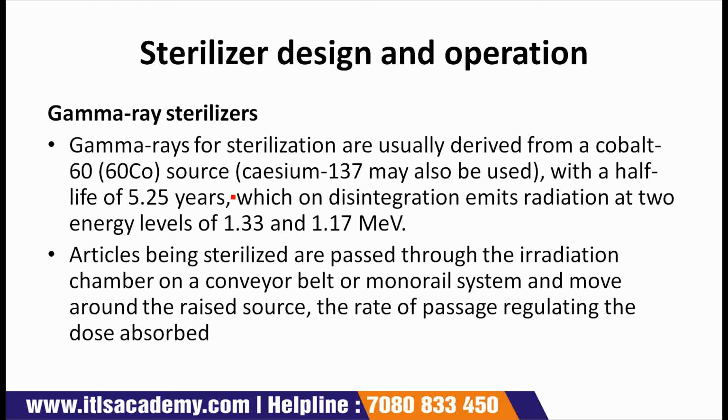Sterilizer design and operations for radiation sterilization. So first one is gamma ray sterilizers.